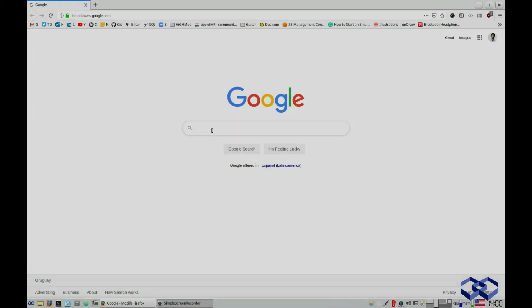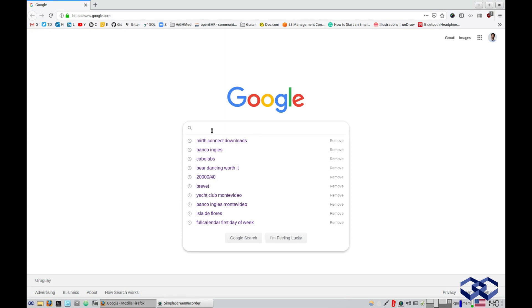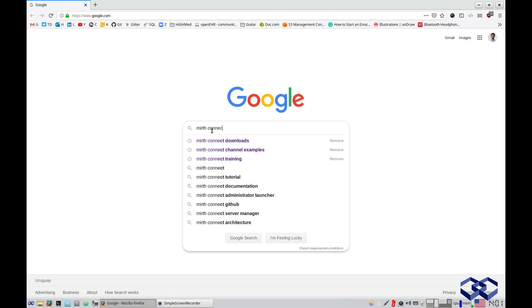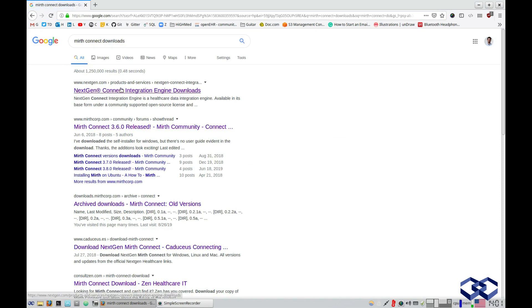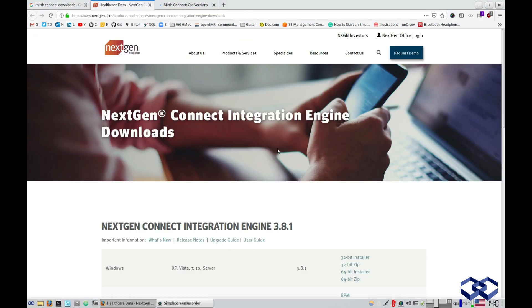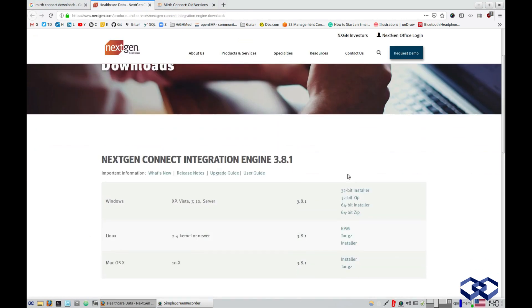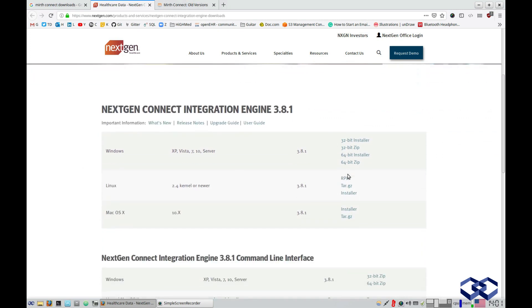In this video, I will show you the first step you need to do before installing MIRTH Connect. We are going to download MIRTH Connect first. We'll search for the correct version and I'll show you a couple of options. The first option is to go to the NextGen download page — this is the official NextGen download page for MIRTH Connect.